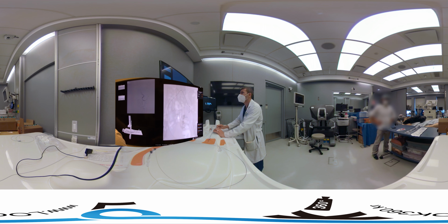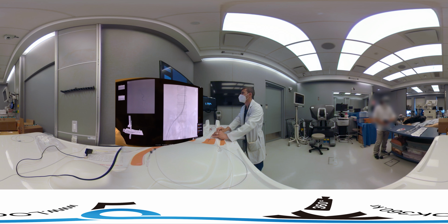And you're going to see me come down with this big loop into the ipsilateral leg. So we're going to come down, push it back up. We'll come down with a wire first, maybe, on this one, in the ipsilateral leg. And we'll pull down here. We'll bring it right around where we think the internal should come off, on the ipsilateral side. And we're going to do a little injection here just to prove it.